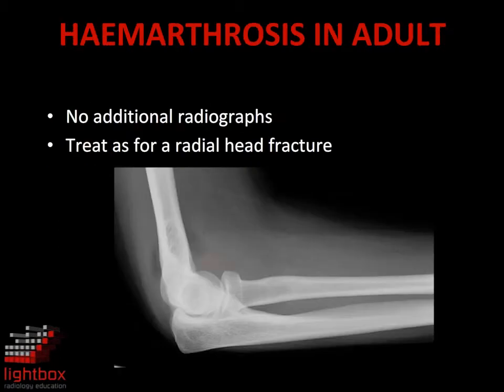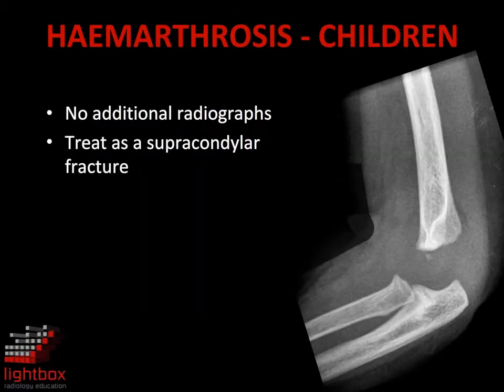Fractures around the elbow may be very difficult to visualise if minimally displaced. In the setting of trauma, if there are signs of a haemarthrosis, an occult fracture needs to be considered until proven otherwise. In an adult, this should be considered to be a radial head fracture, with clinical follow-up to reassess. In a child, this should be considered to be a supracondylar fracture, with clinical follow-up to reassess.